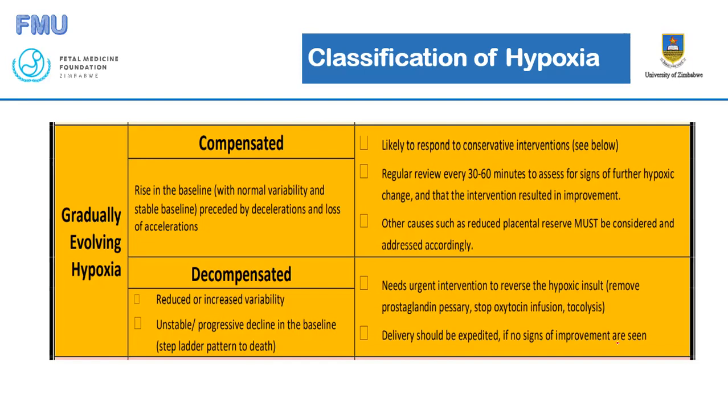I think my last question is on CTG. I remember reading somewhere that it increases the risk of cesarean. I appreciate the use of a CTG, but just to critique that, does it not increase the risk of getting a cesarean section done without necessarily improving perinatal mortality rates?